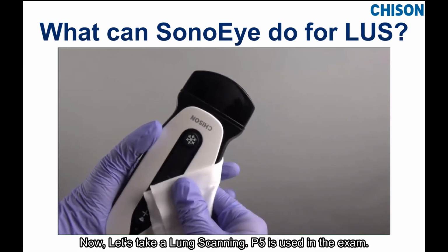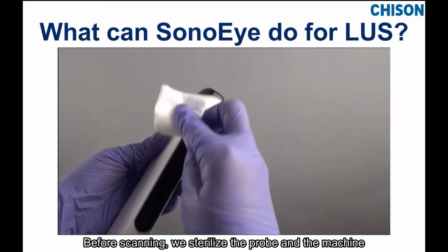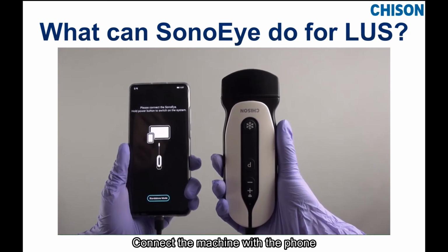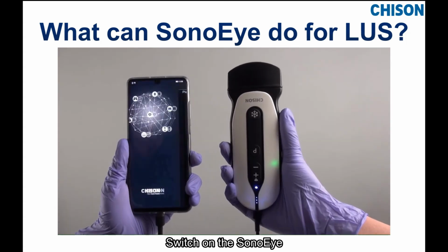Now, let's take a lung scanning. P5 is used in the exam. Before scanning, we sterilize the probe and the machine. Connect the machine with the phone. Switch on the SonoEye.